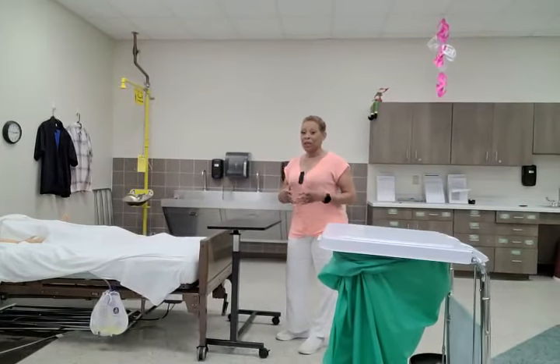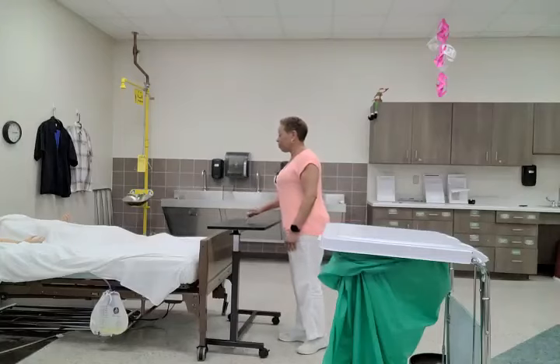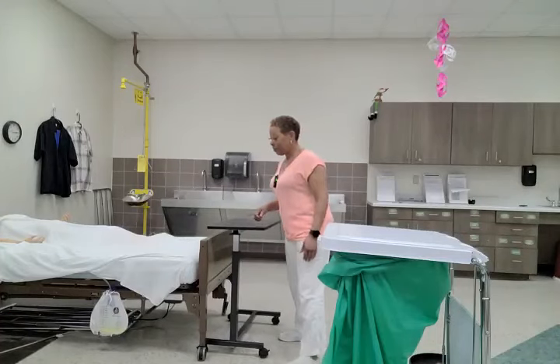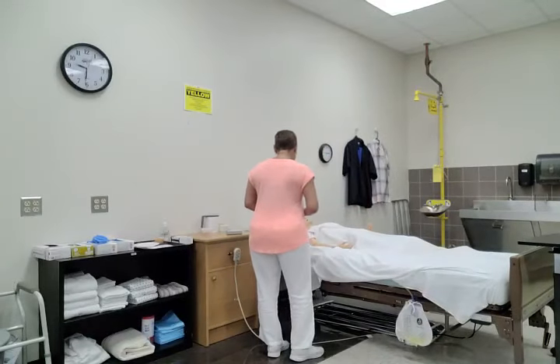As with every testable skill, you'll want to start out with your opening procedures so you can take care of all of your initial indirect behaviors. Hi, good afternoon Mrs. Jones. How are you? My name is Julie. I'm your CNA and today I'll be emptying your urinary drainage bag and measuring and recording your urinary output.